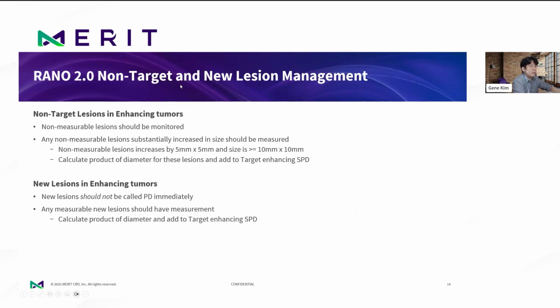And for non-target and new lesion management, particularly in the case of the enhancing lesions, non-measurable lesions and new lesion appearance should be considered in this way.